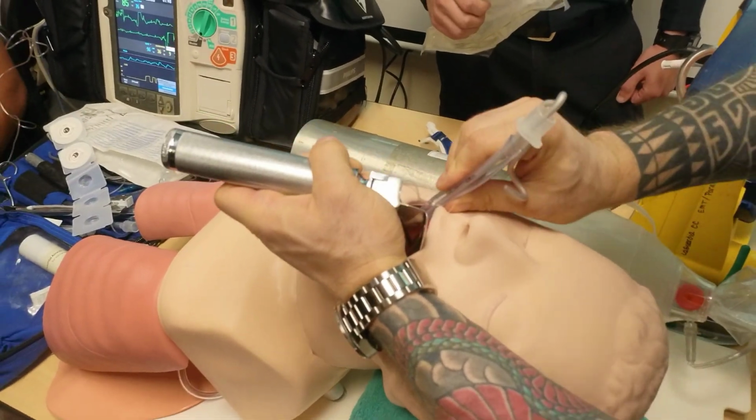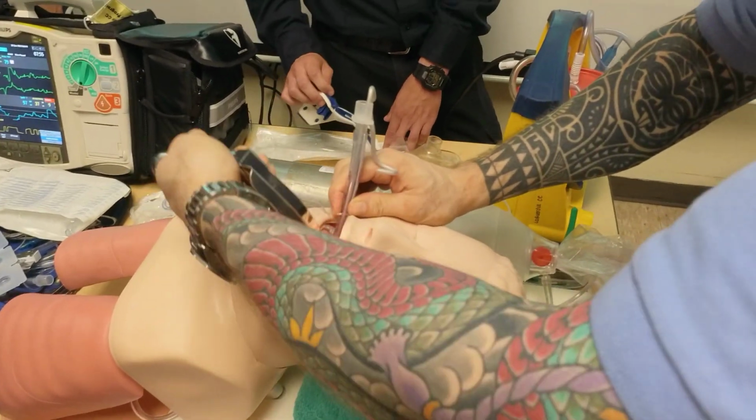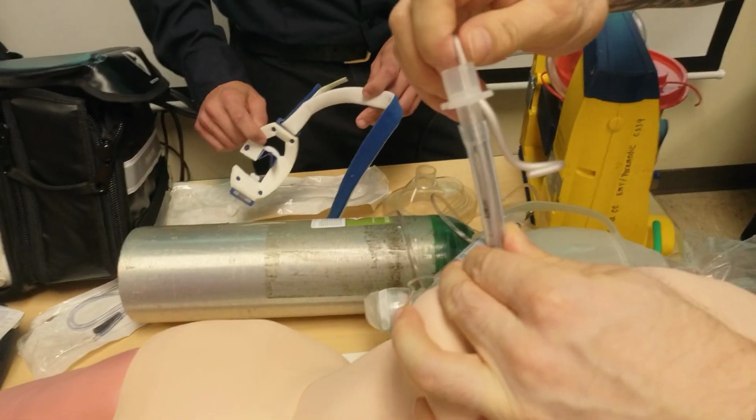All right, you see that? 24 at the lip line, 24 centimeters. Everybody see that? I still have my eyes on it. I take out my blade. I collapse.